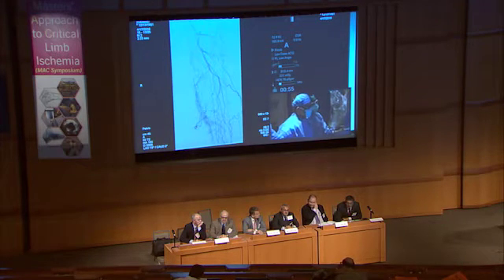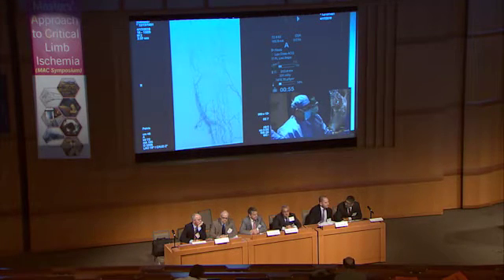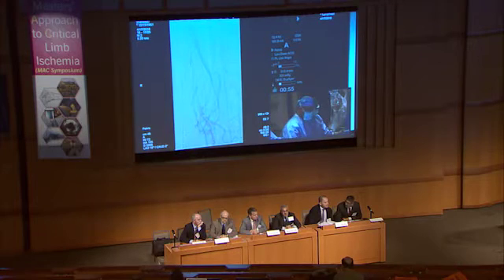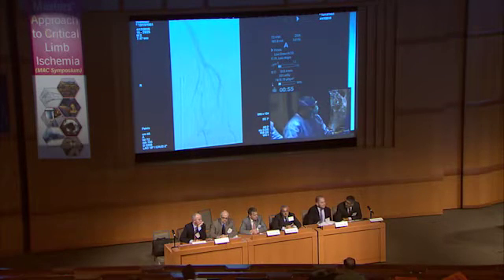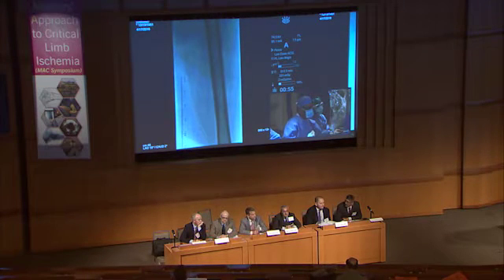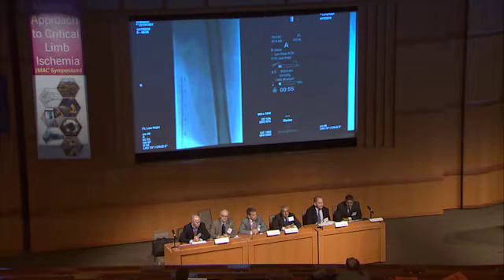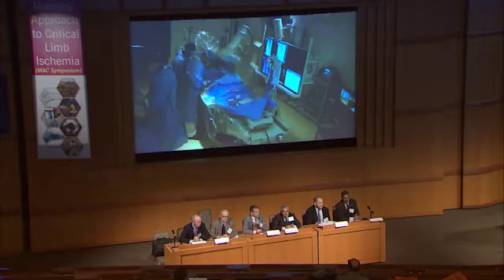So Bruce, you see this is a popliteal injection, and you do see profunda. Yeah. A profunda injection, and you do see some filling of the vein. So does it change your treatment plan right now, or do you just keep going and put some covered stents? I'd still like just a selective shot of the SFA after angioplasting it, and then use that information to make a decision on how much to cover. Okay. I'm going to remove this from the profunda because I think we got our answer from the profunda. So let's give a selective shot of the SFA.